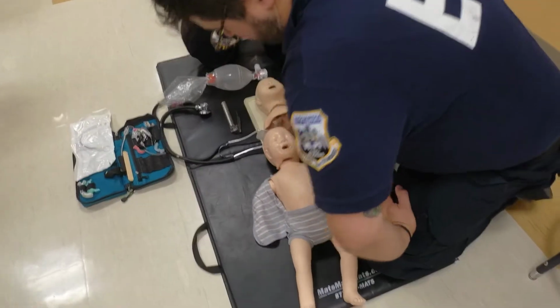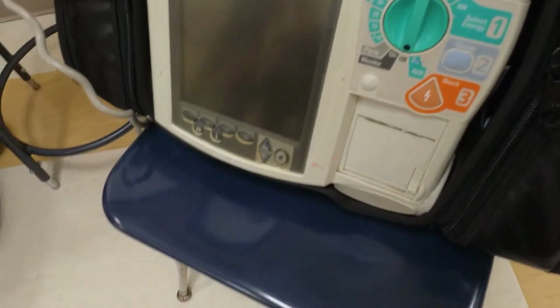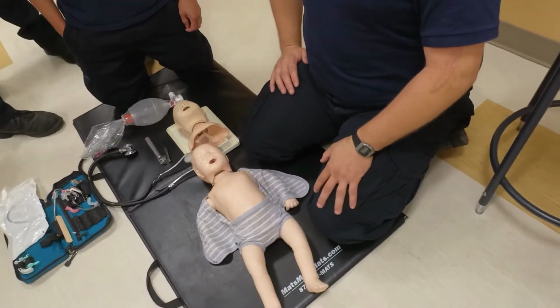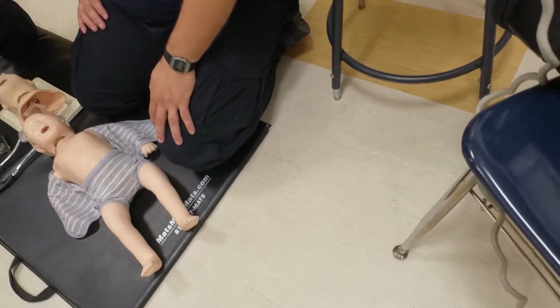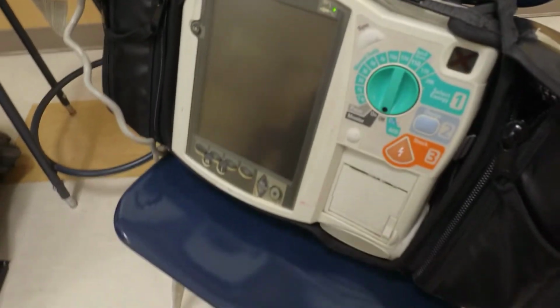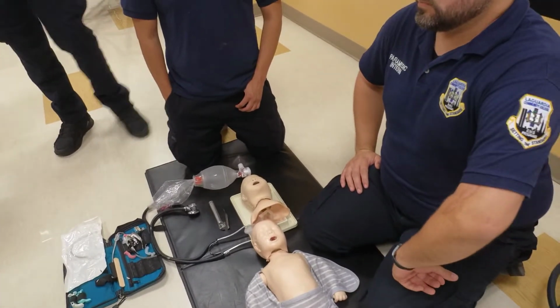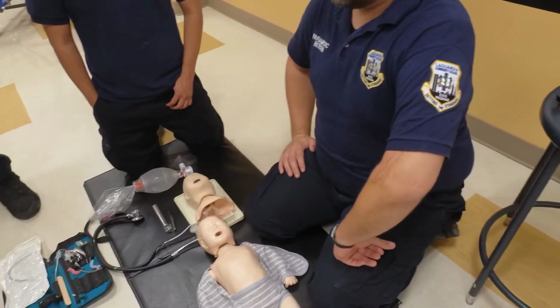Very good. Synchronized, right? So if I give you the weight, make sure you write this down, and how you're going to adjust it. You see the numbers here. Let's say your patient is 20 kg. 20 times 2 is 40 for the first, so you're going to put it at 40. If you don't have 40, you have 30 and 50. What are you going to do? Go to the lowest one first, and then you could increase your settings.